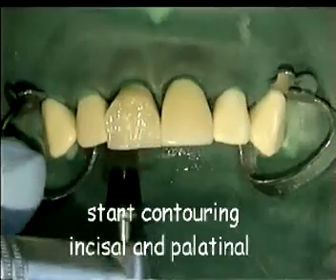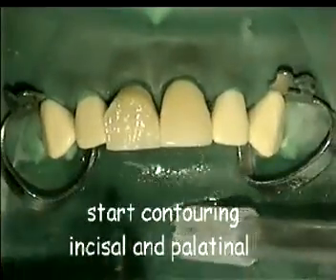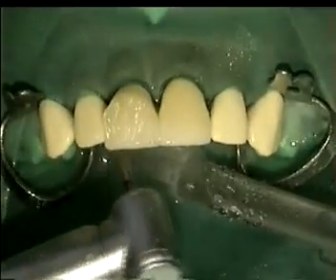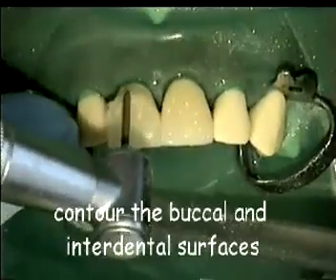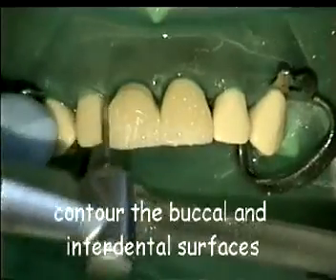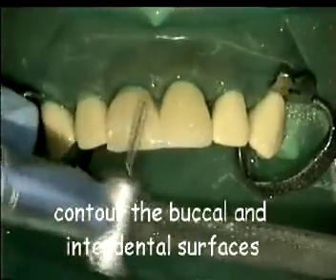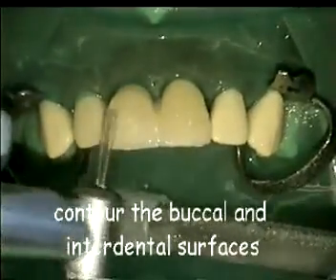Start contouring and finishing by adjusting the incisal height. Then adjust the palatinal surface. Then adjust the interdental and buccal surface.